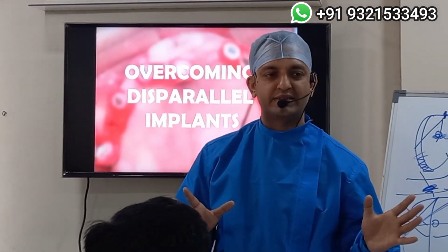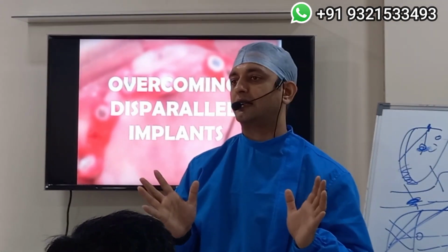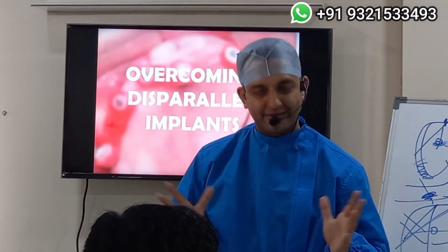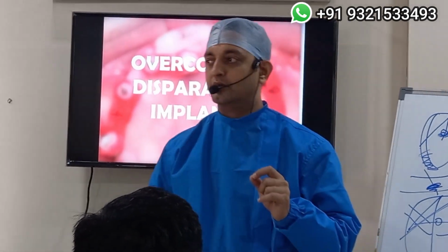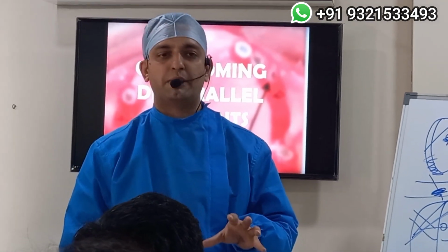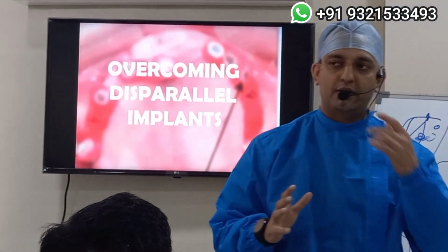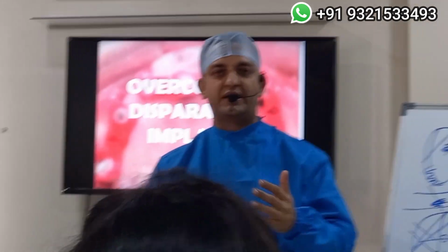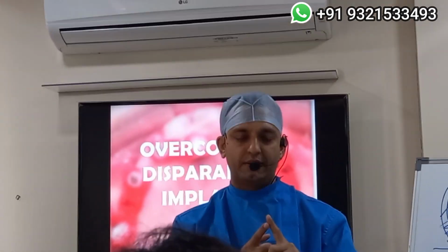So as we know, when we are placing the implants, which is surgically driven, we get divergent implant abutment heads, and we need a strategy to correct them and get a good path of insertion for our prosthesis. This is one of the most important yet ignored things, where people feel that just by milling the abutments we will make the implants parallel. But the moment you try and do only that, a lot of compromises set in, which we will discuss. So that forms a very important part.